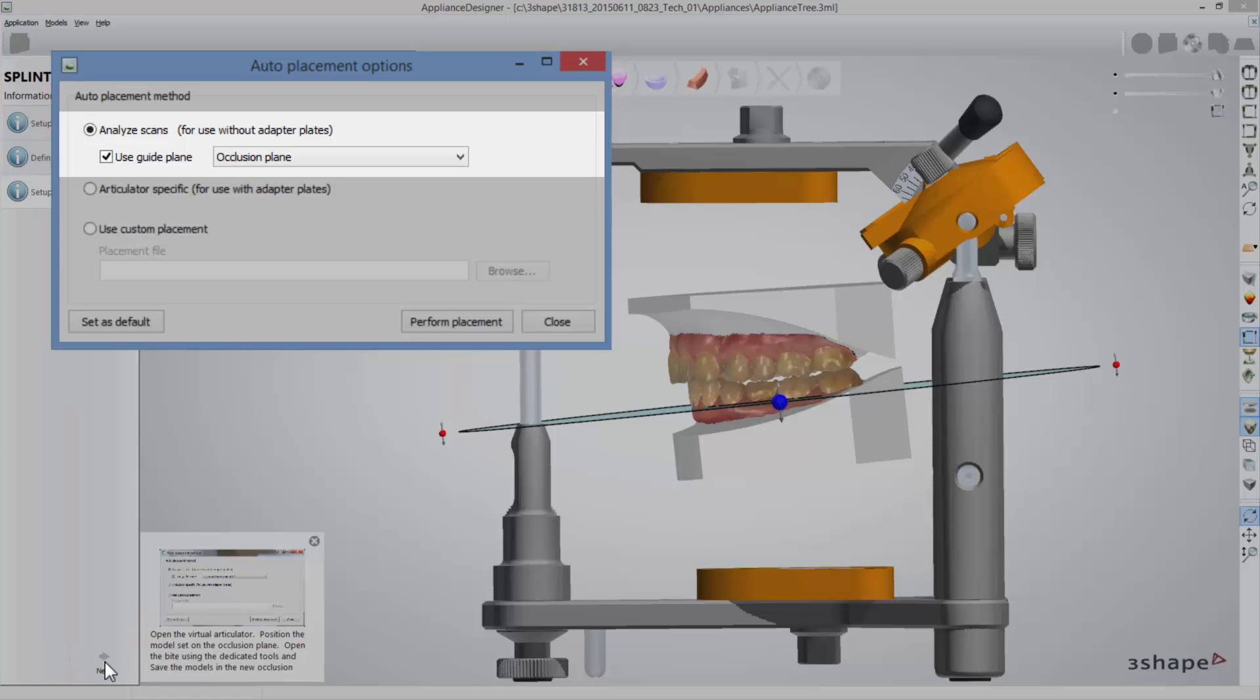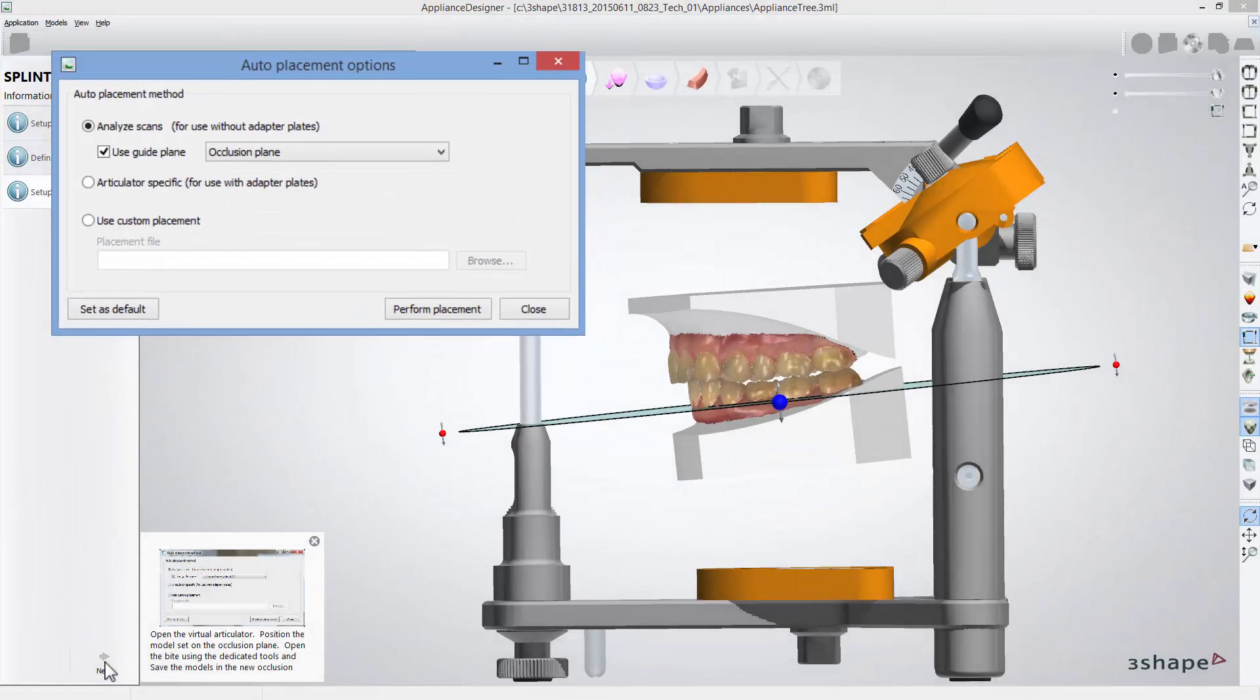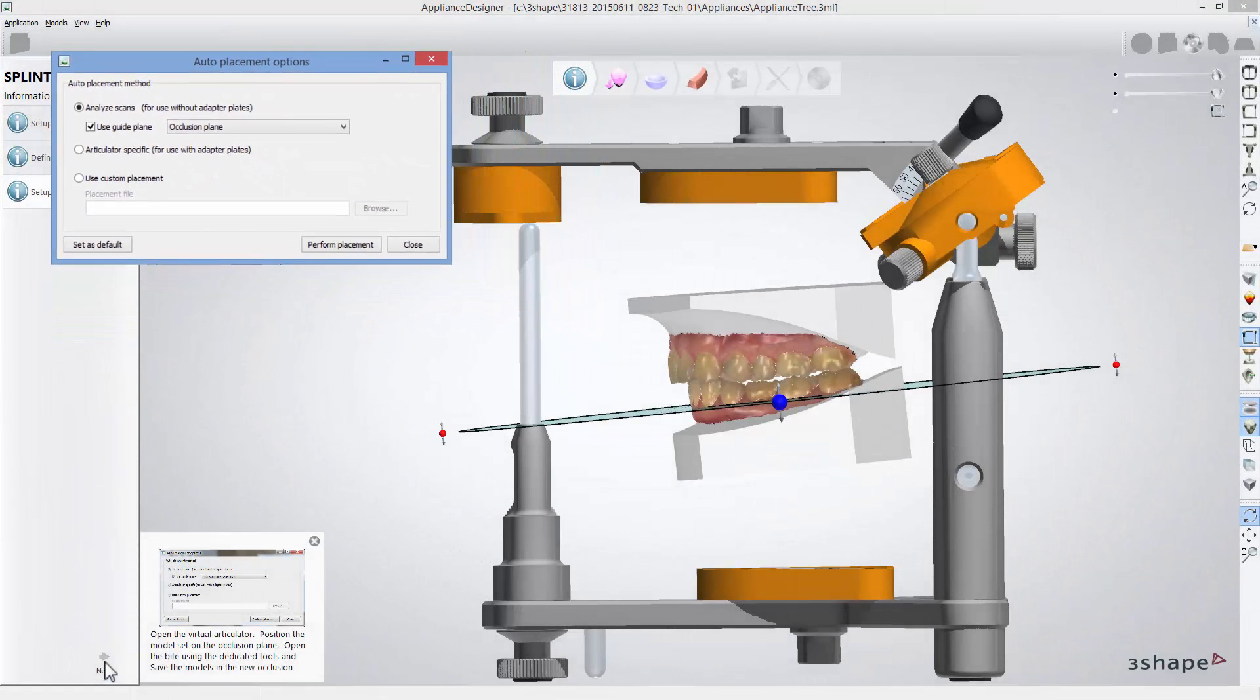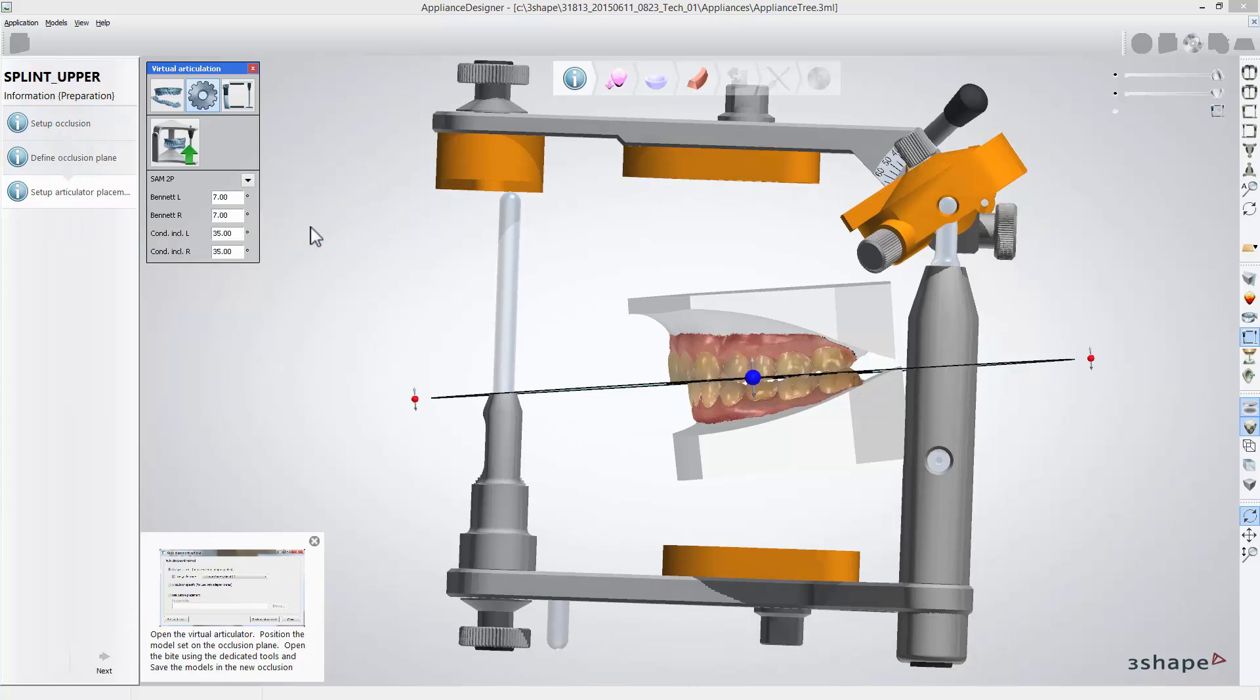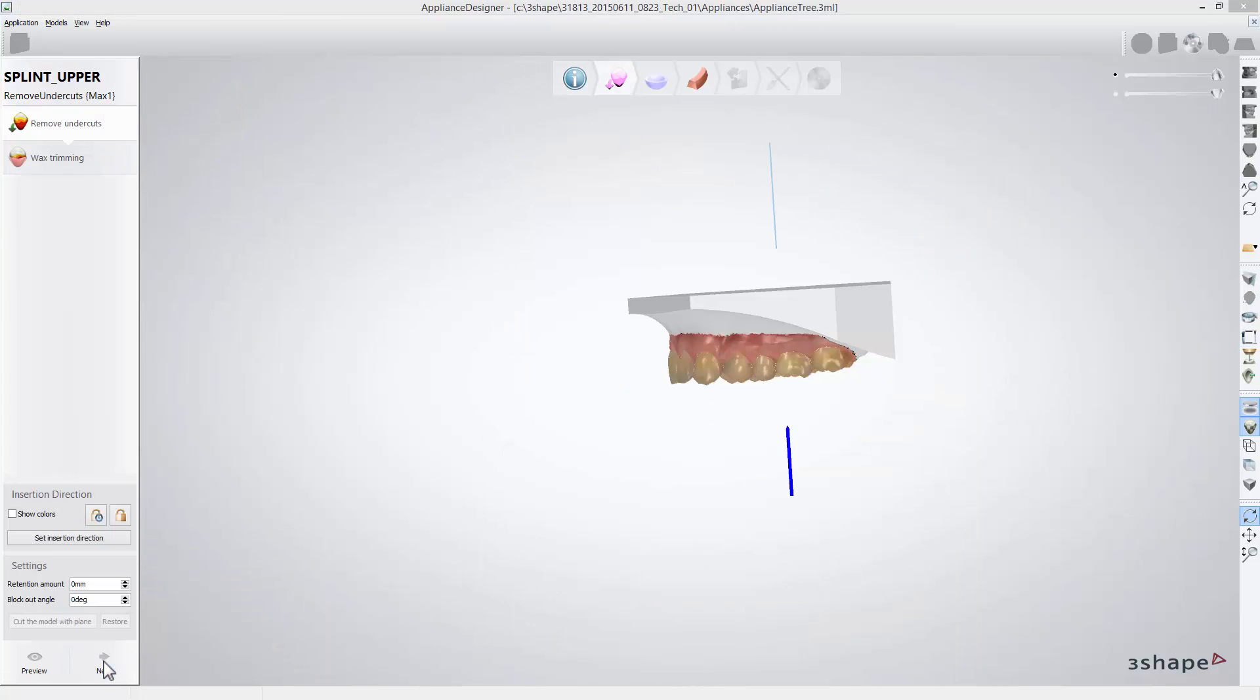Select plane in relation to which you would like to set models. Then click perform placement to do so. When done, click next to get to the further steps.